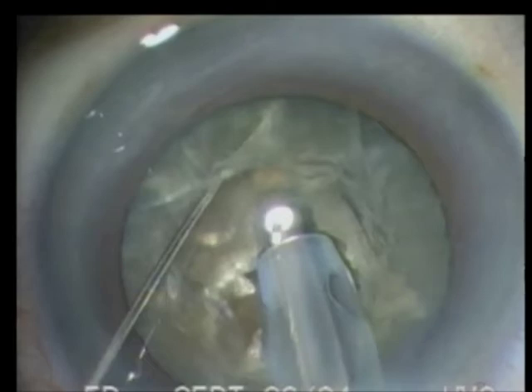This is where the Legacy, with its low-level control of ultrasound, allows one to thin the nucleus safely. By creating a crater, the nuclear rim remains, which acts as a safety mechanism, keeping the capsular bag distended. To perform the crater chop, the ultrasound tip is driven into the dense nuclear rim with a burst of ultrasound, then the chop instrument is inserted under the anterior capsule and brought toward the phaco tip to split the rim.